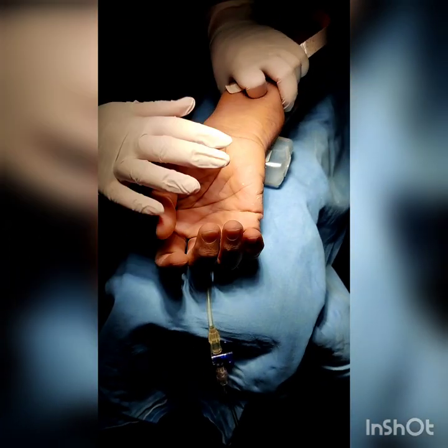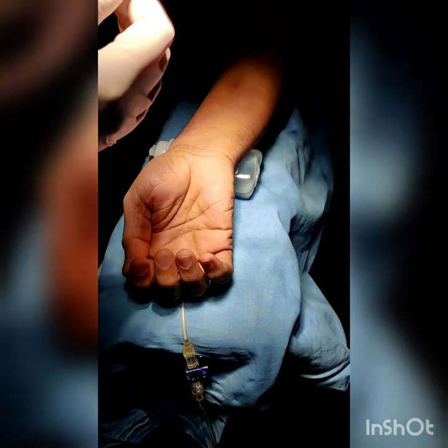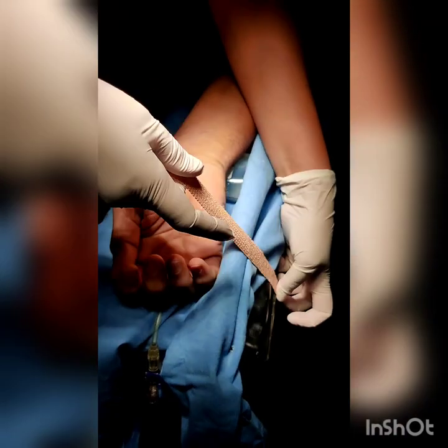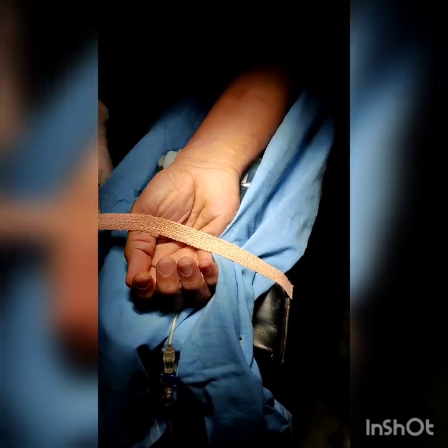For the arterial cannulation, the patient lies in supine position with the entire arm outstretched and rested over the handrest. A small roll of sheet or a 100ml saline bottle is placed under the forearm just proximal to the wrist, and the forearm and hand are taped down to the handrest.